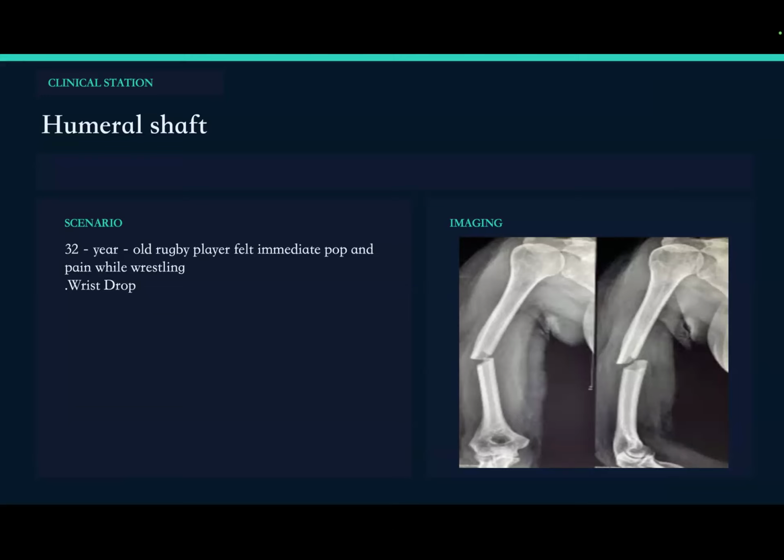However, I would request other orthogonal views, including the lateral view of the right humerus, and also I need to get full x-rays for the right elbow to exclude any other injuries there. My main concern for that patient is going to be neurovascular status, especially for the radial nerve, skin in terms of open fracture, and also compartment syndrome.